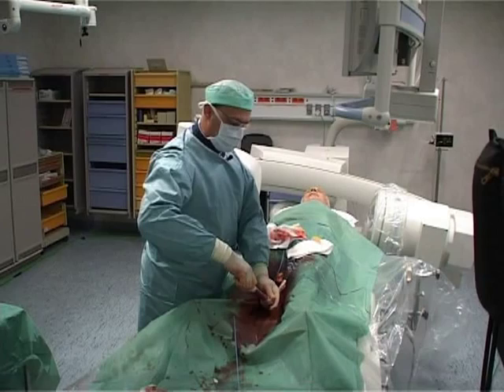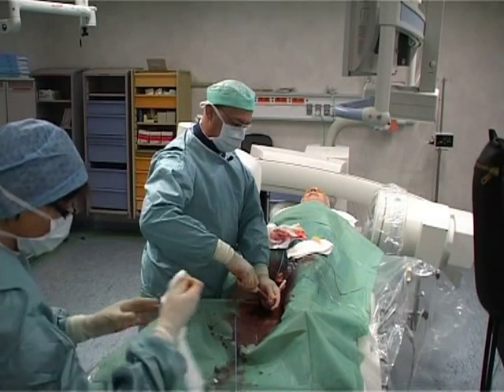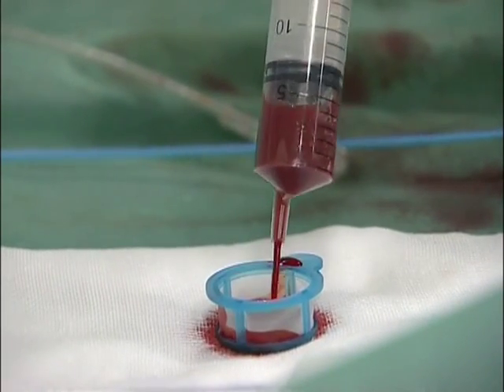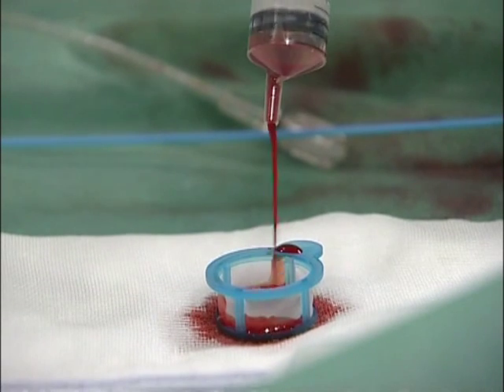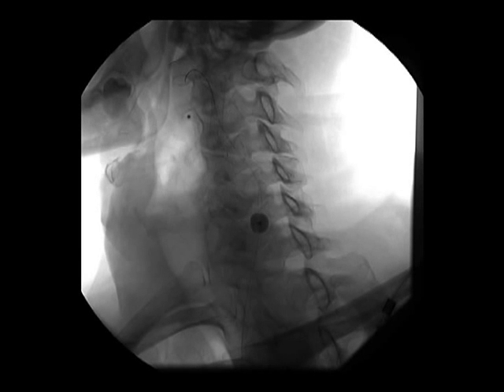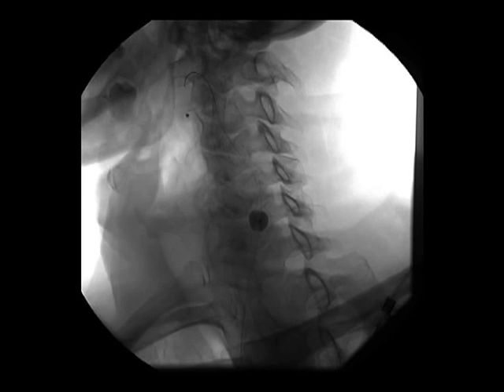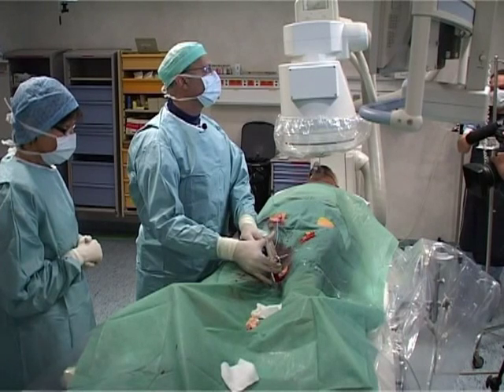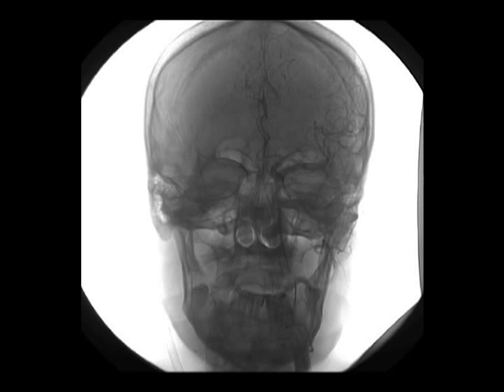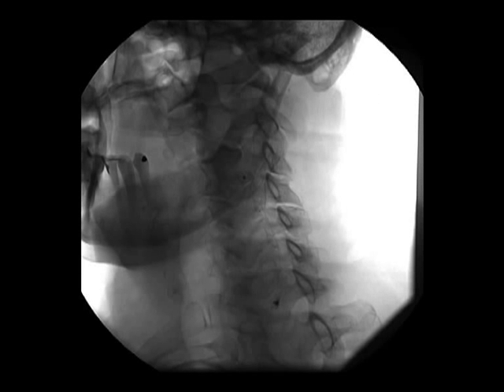And before deflating the balloons, we aspirate 60 cc of blood, and we filter the last syringe to see if there's any debris in it. Then we deflate the balloons. Checking the result. Here we see a very nice result. Withdrawing the MoMA catheter.